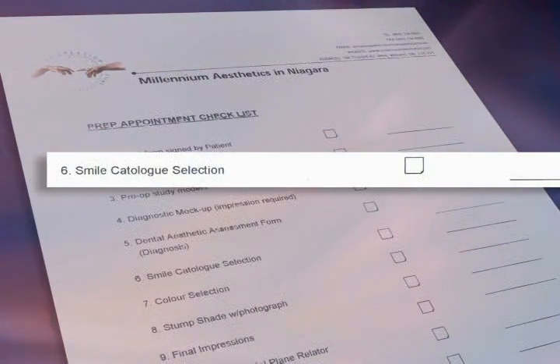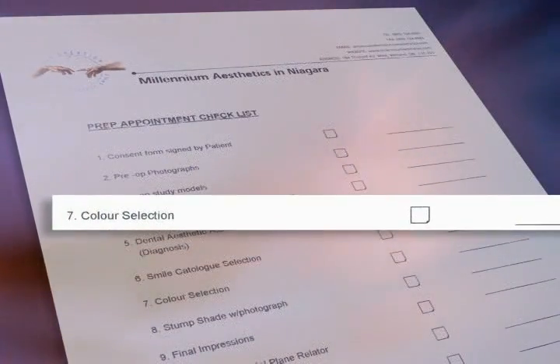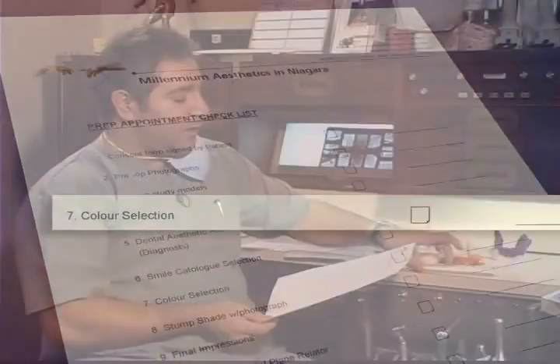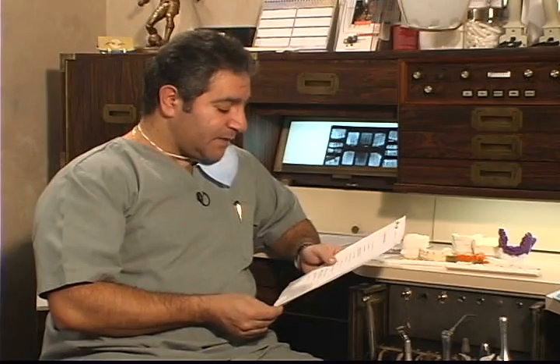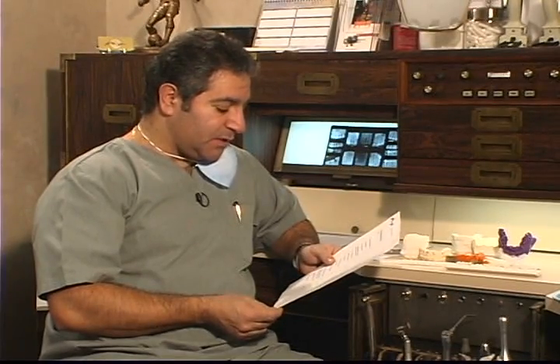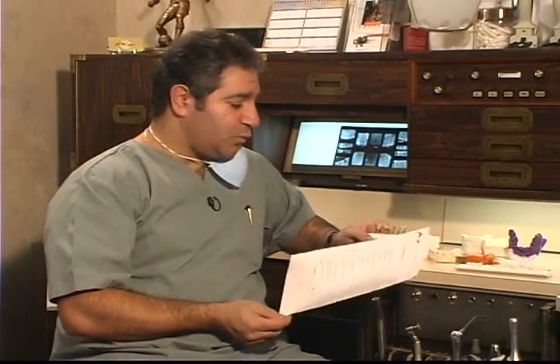We've selected the enhanced mold and also our color selection. We've already predetermined it was going to be from the Chromoscope shade guide from Ivoclar — 130, 120, and 110 will be our three shades going from cervically to incisally. The next item on the checklist is our stump shade. We selected our stump shade prior to taking our final impressions, which was the ST9.